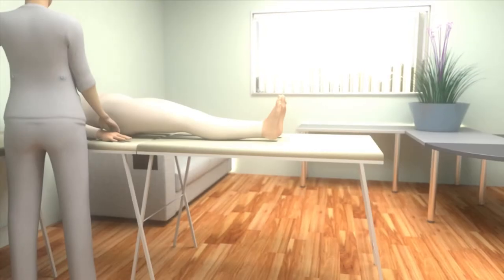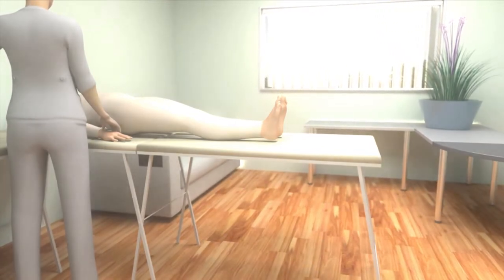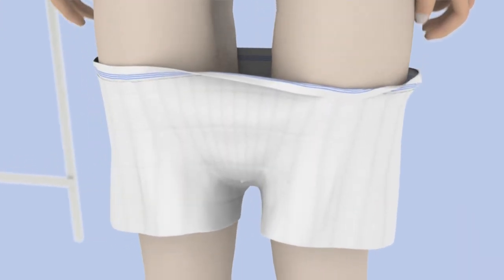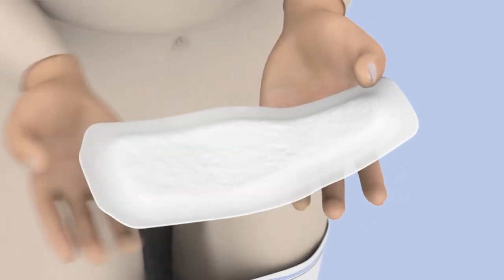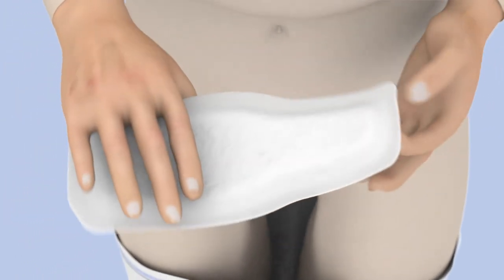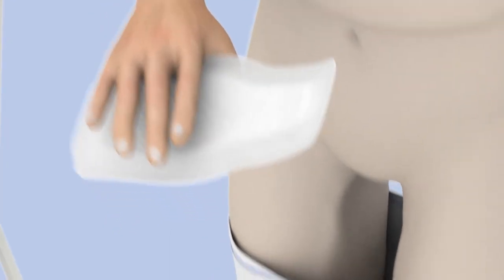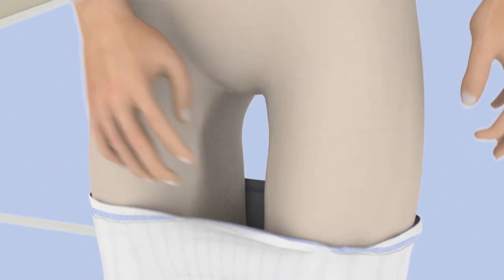To ensure the comfort and security of the patient, it's important that this product is fitted correctly. Start by pulling down the underwear to the knees. Then unfold the ID for men pad and remove the paper from the adhesive strip. Ensuring the wider part of the product is at the front, place the pad inside the underwear, making sure the adhesive strip is securely fastened to the underwear.